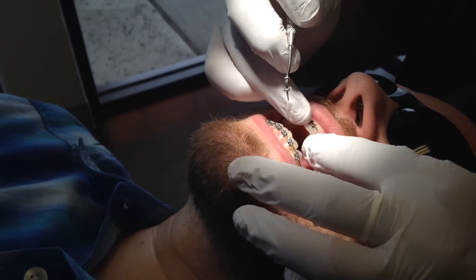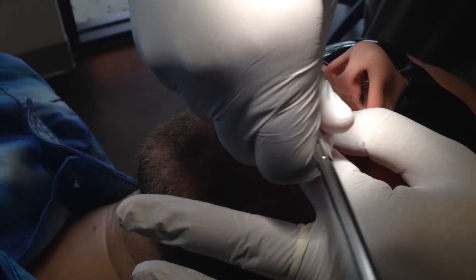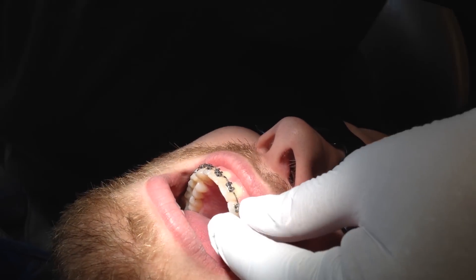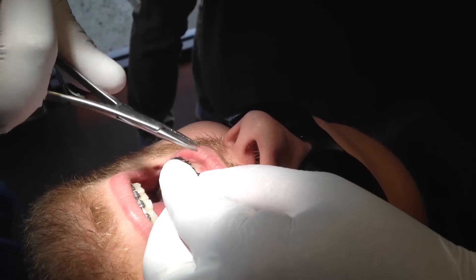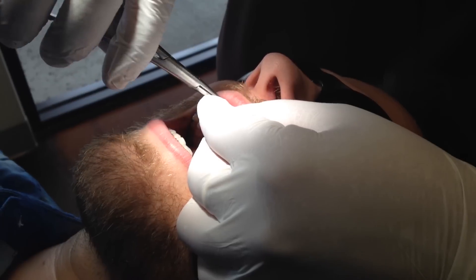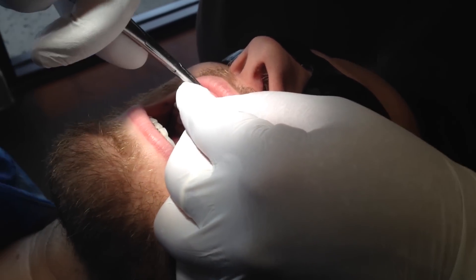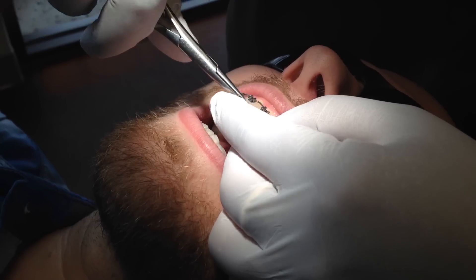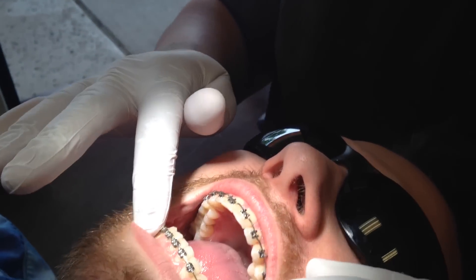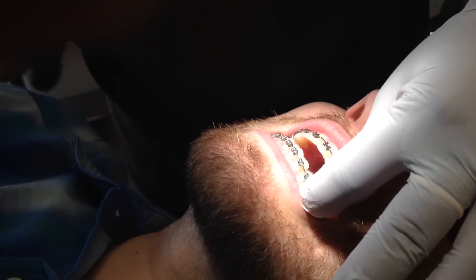He had a one and... all of them. Both ones and then the two. Do you want to do the address for this? I was going to go in there, I'm just going to take this off for doctor. Do you want to do the colors and still tie the wire right? Go on the left side. Alright doc, here you go. The wire's about to untie his lower. You got gloves still? Okay.